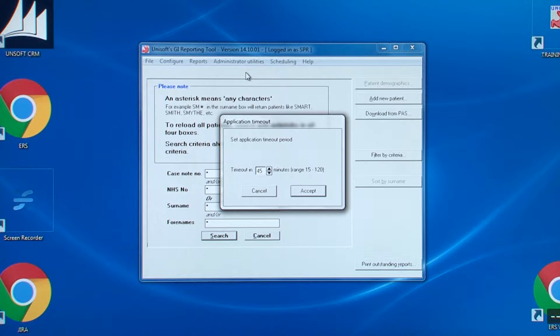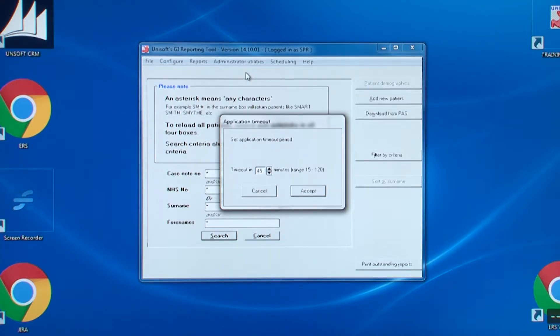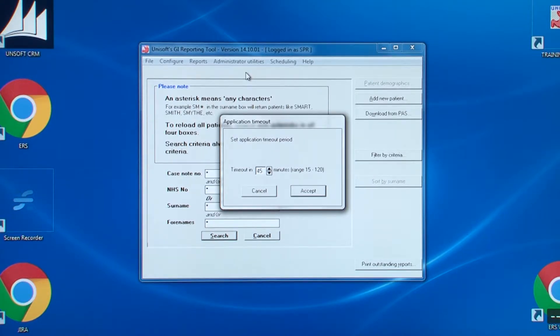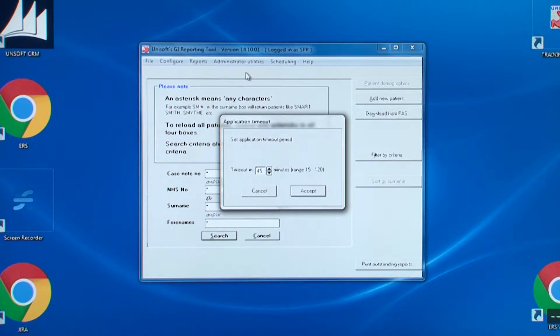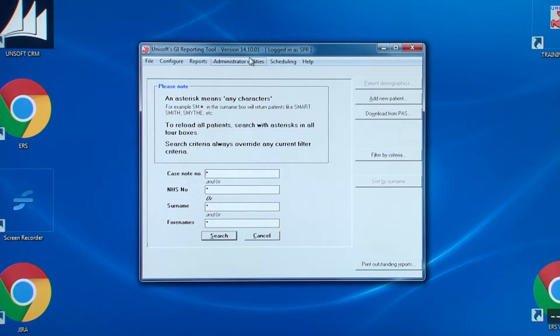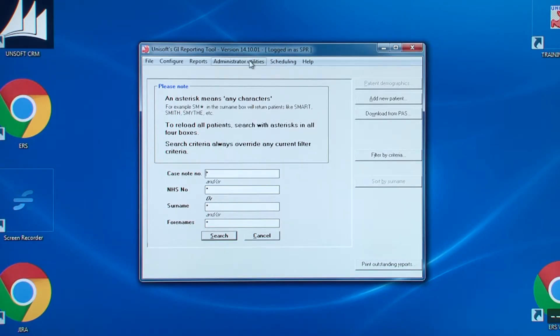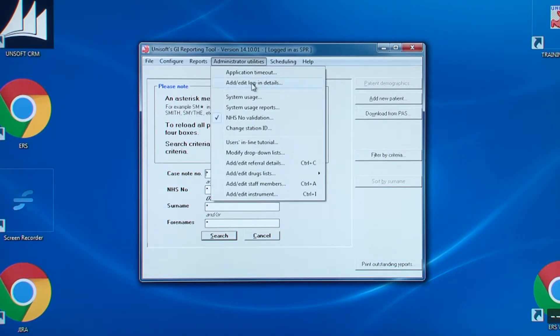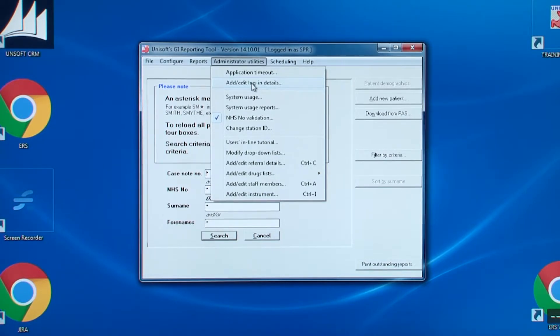But if this PC is in X-ray for example, where ERCPs are carried out, the time can be increased. The second entry on the administrator utilities menu is add, edit, login details. But before we look at this, let me explain.